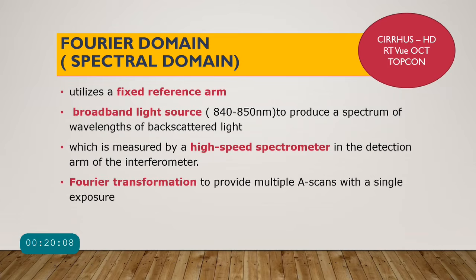Next, what do we have is the Fourier domain OCT. Now, the term Fourier is actually coming from the Fourier's transformation principle of physics. Now, I will tell you in a while what is meant by Fourier's transformation.